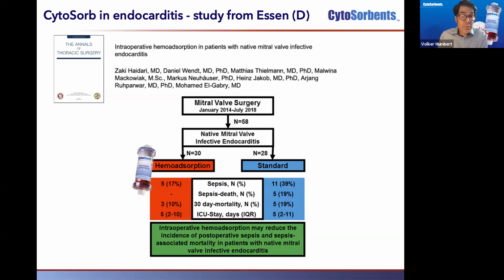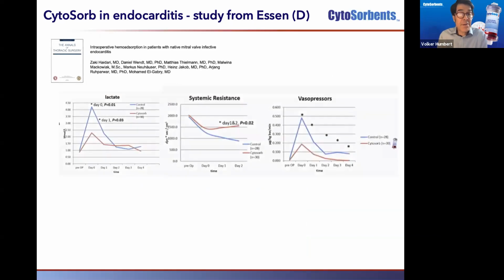So the intraoperative hemoadsorption, as the authors also stated, may reduce the incidence of postoperative sepsis and also the sepsis-associated mortality. Next to this, they could show effects on the hemodynamic stabilization, which is generally one of the most well-known effects of Cytosorb therapy, to have a lower need for vasopressors, to have a lower level of lactate levels, a better systemic resistance, and also better metabolic stability.